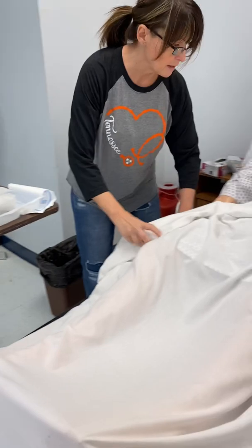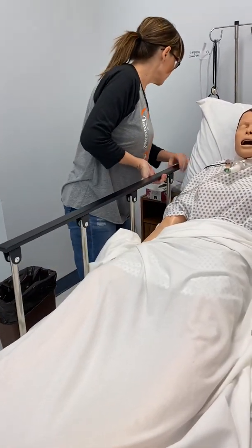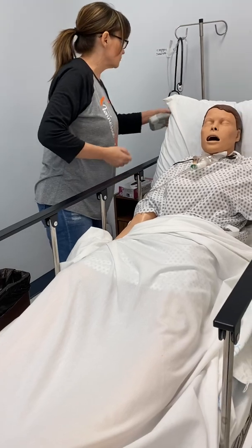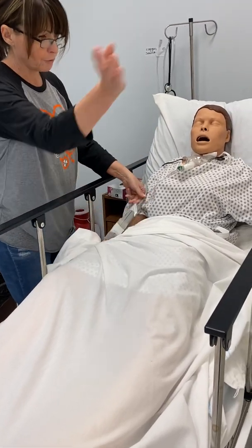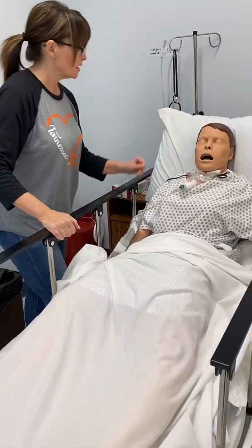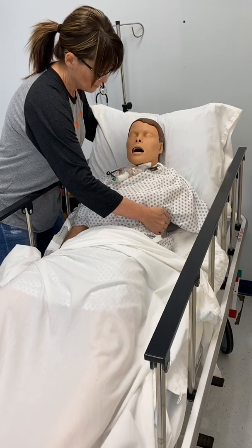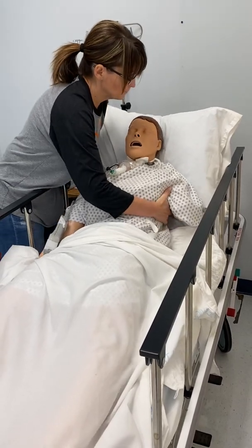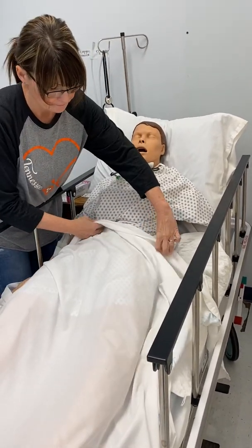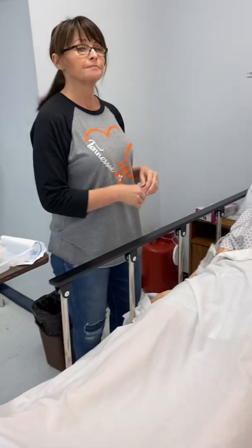I'm going to clean up my mess. I'm going to wash my hands. I'm going to raise this side rail. Put his call light in reach. Pull the curtain back. Put his bed in low position. And put him in a position of comfort. A little bit there. There we go. And then I would go document the procedure and how he tolerated it. And that's it.